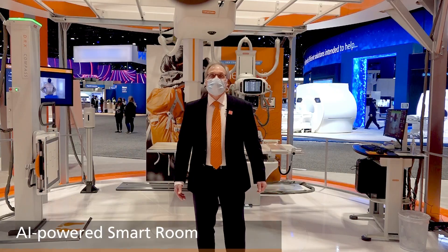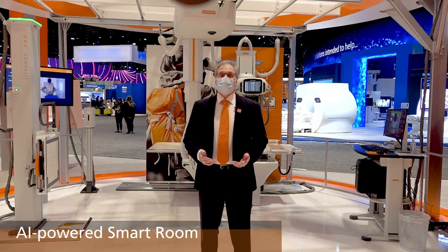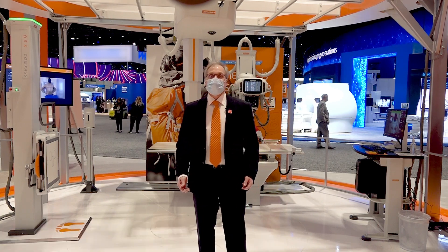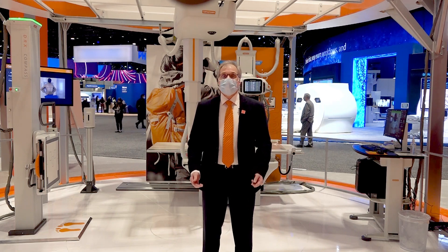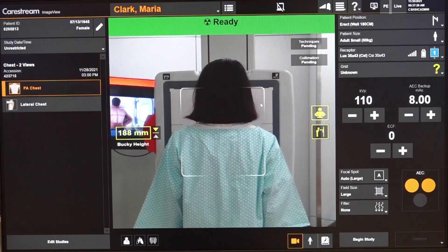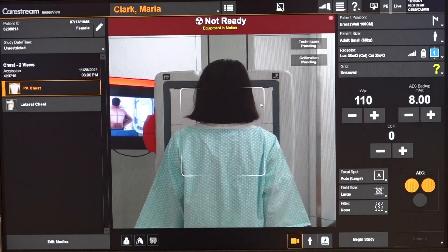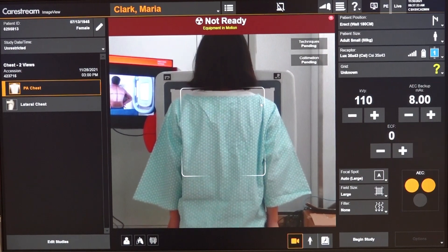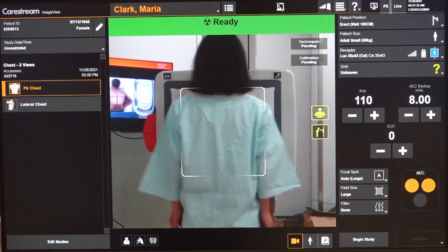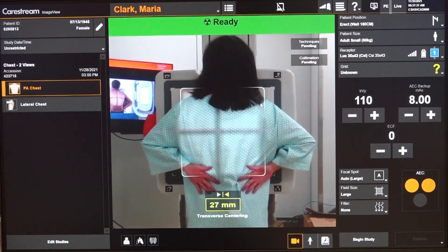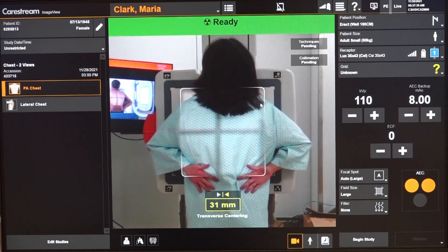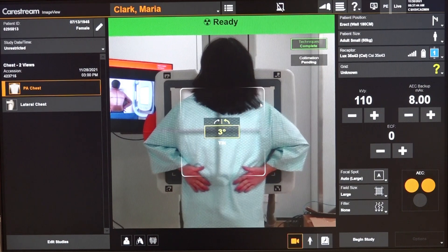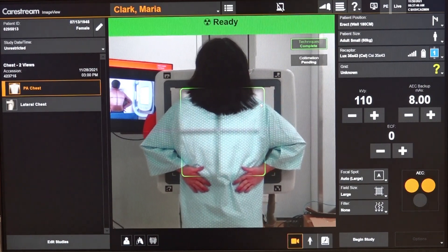Our Smart Room, available on our DRX Evolution Plus and DRX Compass systems, utilizes AI to help a facility improve productivity, consistent imaging, and ultimately patient care. This provides automatic positioning of the equipment, patient positioning feedback, automatic collimation, and automatic technique. We do this by helping to automate manual tasks and assist the radiographer with intelligent and useful information that helps them spend less time manipulating the equipment and more time on what is most important: the patient.